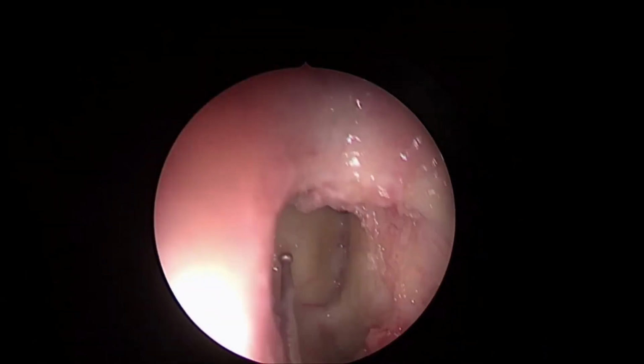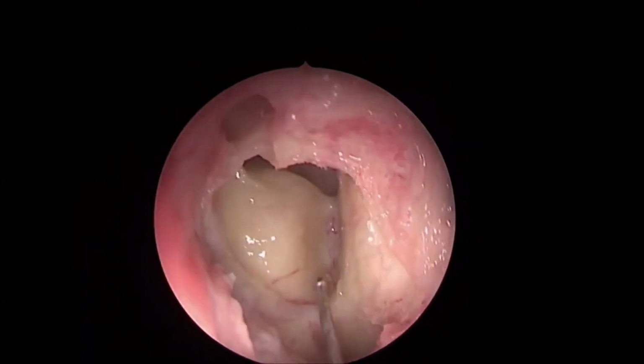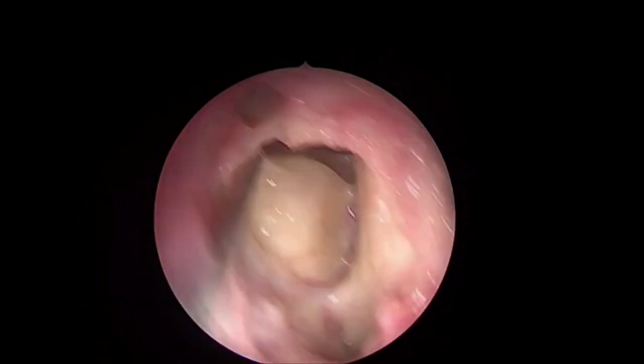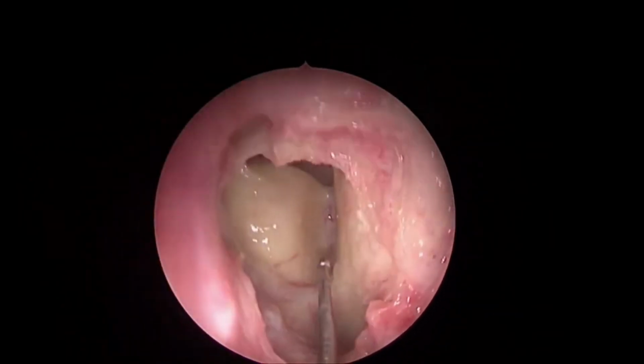There is no question of discussion regarding size in centimeters or so. No point. As long as you flush to the limits with, like Professor Pepagaran said, keeping the mucosa intact, it is good enough. Maybe it is 7 millimeters, maybe 2 centimeters, it doesn't make any difference for that particular patient.